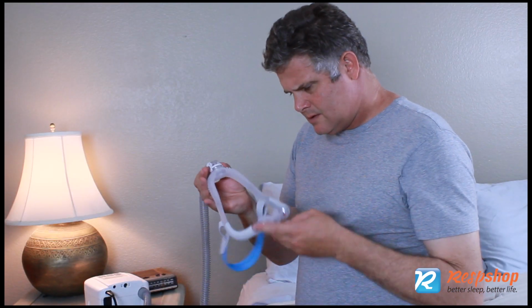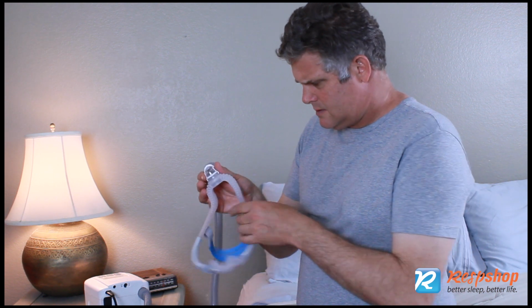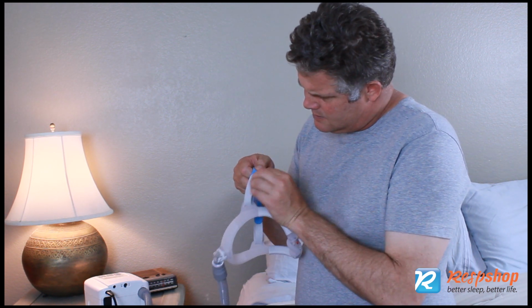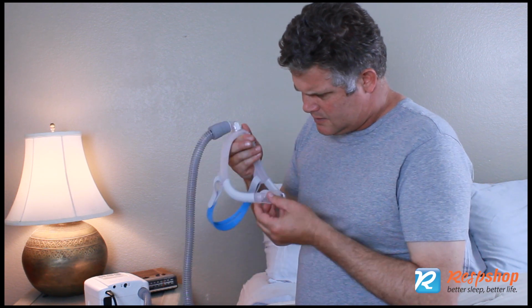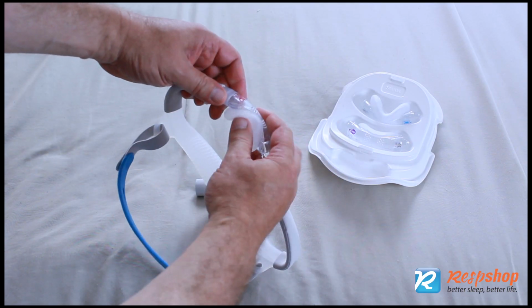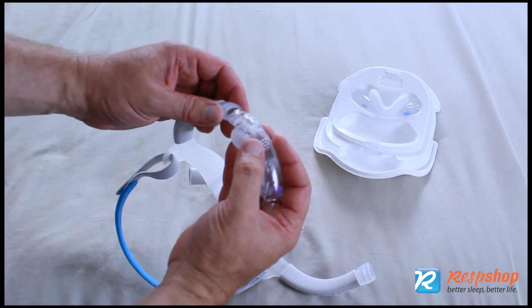If the leak is an ongoing night after night issue, make sure that everything is sized correctly. Parts that are too small or too big will leak. You really do need it just right. Use a sizing guide to confirm that you have the right size for each component. Don't be afraid to mix and match component sizes. Maybe you need a small mask but a medium headgear.